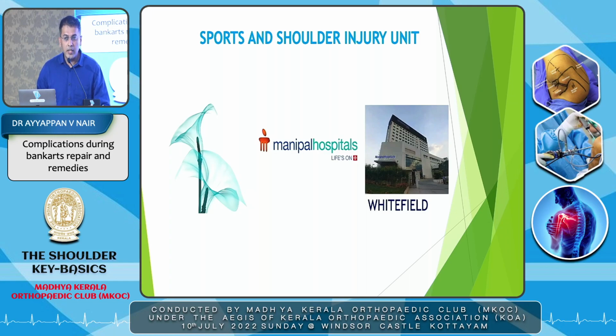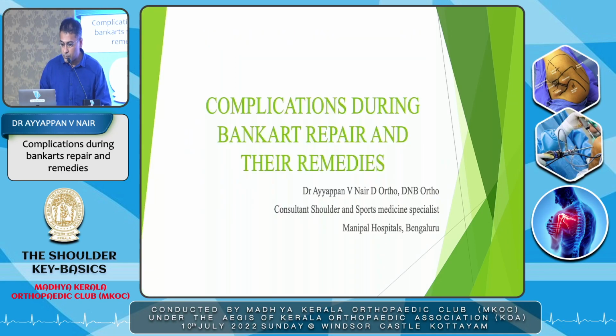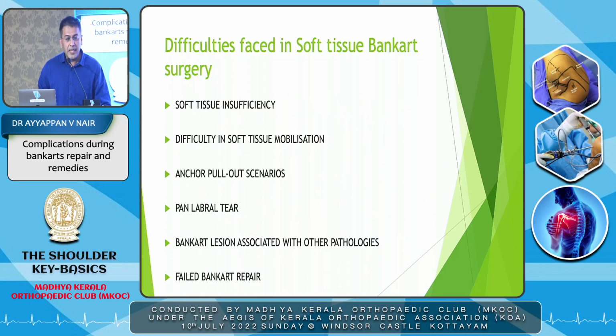So I'll be speaking on complications during a Bankart surgery. It's been mostly covered by the other speakers in one way or the other. The difficulty we face starts from the portal placement. Making the entry is the most difficult thing for the beginner. When I started off, my first case, I found it very difficult. I struggled for 30 minutes to get an entry.